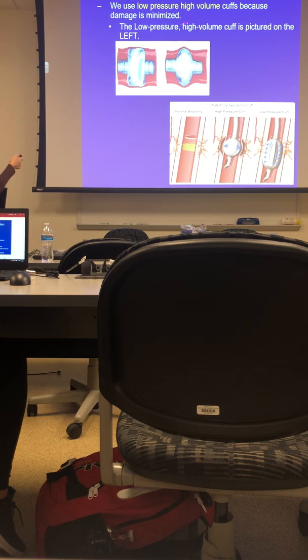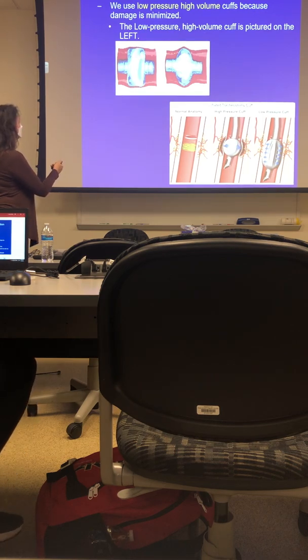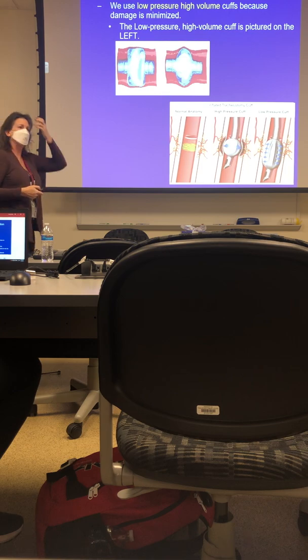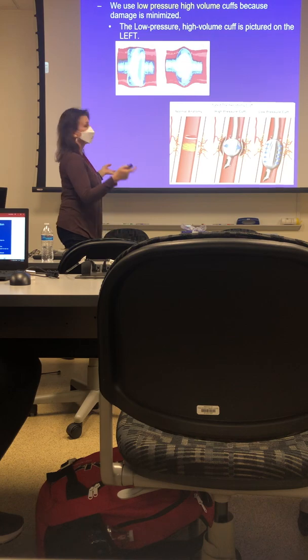Low pressure, high volume. So think about, if your boards ask you which cuff do we use, this one here is a high pressure, low volume. And it's putting more pressure on the airway. I remember at the hospital, everybody was arguing with me because we had to document it.